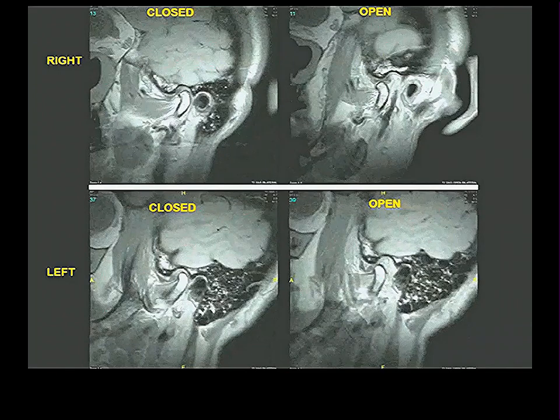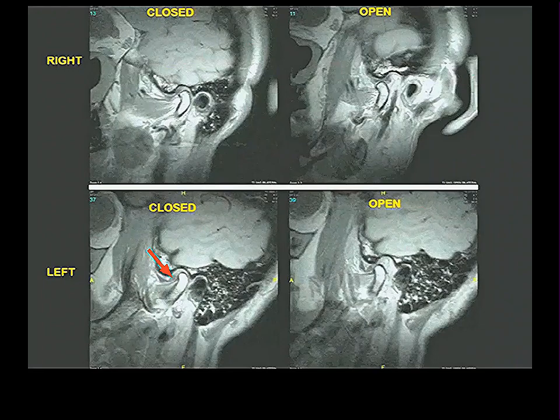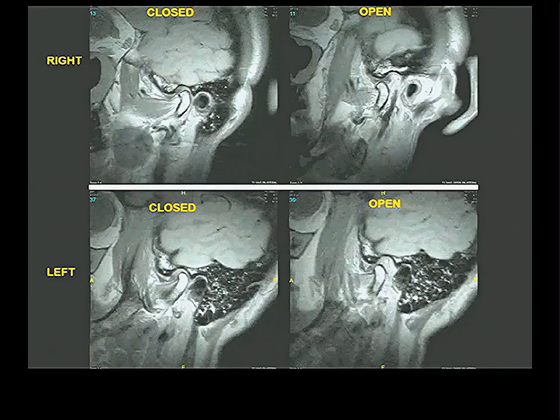So on the damaged side, it's been shifted forward to like 9 o'clock. Yeah, where is it on the damaged side? There. Yeah. Posterior. The damaged side, exactly. The damaged side is right there. Here's the posterior band, here's the anterior band. That band is 8:30 maybe, something like that. That's unacceptable. Look what happens when I open my mouth.